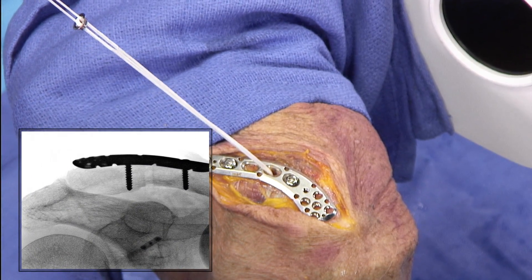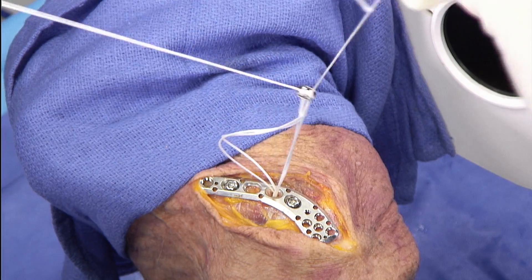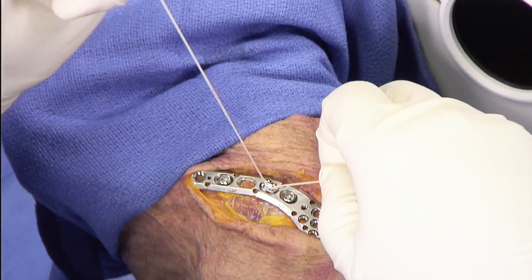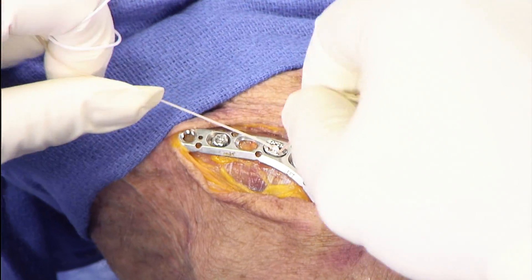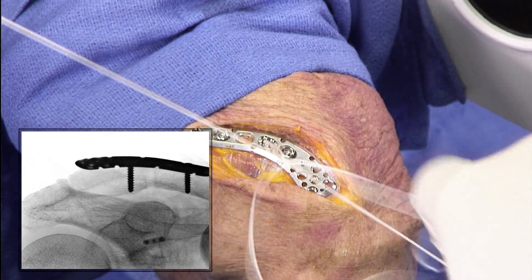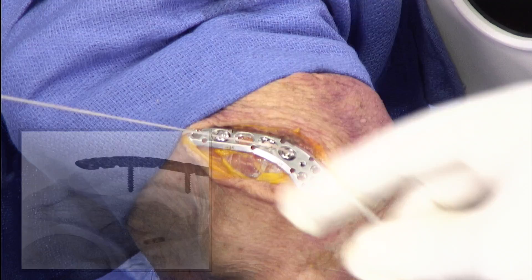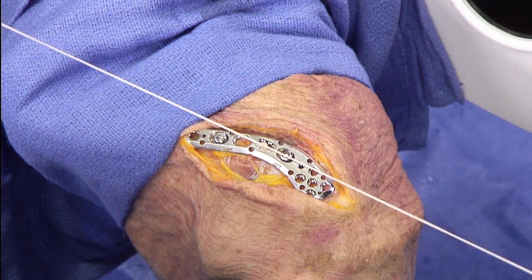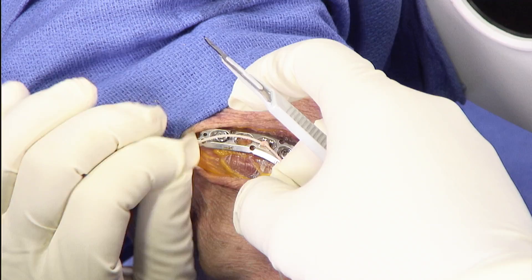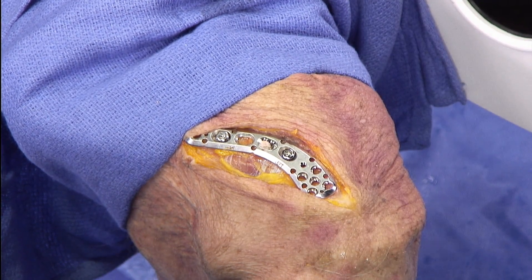Looking inside the shoulder, we can see that the button has deployed nicely under the coracoid. Now it's really just a matter of cinching up our tightrope, which is pretty standard for all of us. You can see how nicely that nestles down into the clavicle plate. Some folks like to back it up with a half hitch or two, but you don't really have to given the studies on tightropes — that's personal preference. Simply cut those sutures short and you're done.